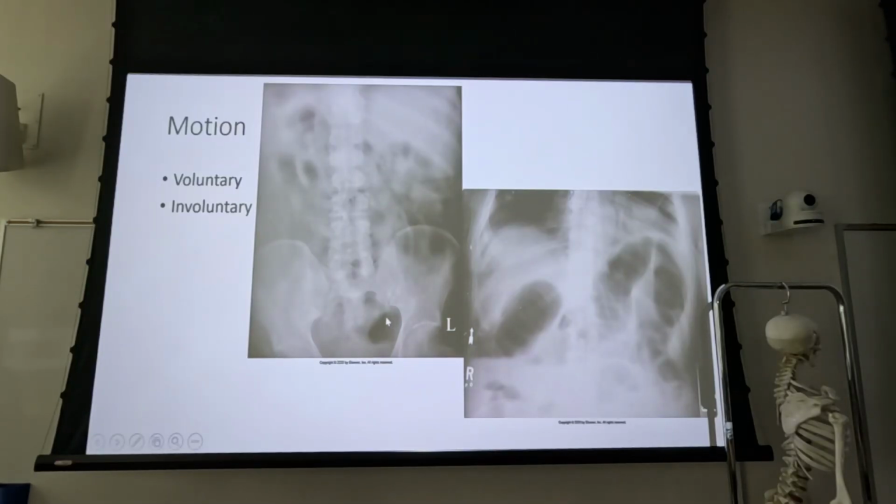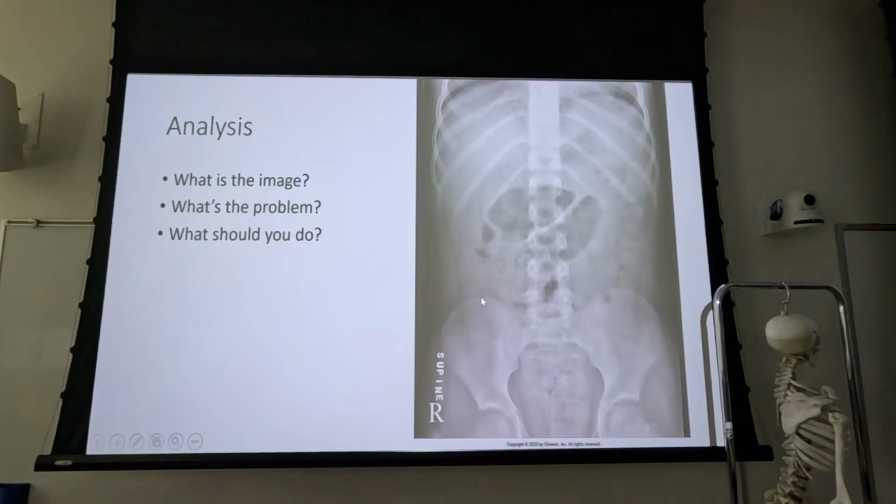it. Well, we got mispositioning here too. Assuming this was KUB, I would definitely shoot a bladder shot for that one. If this one was upright, it's still bad because of the motion, but at least you've got the required information on there. Okay, so again, good KU, no B there.